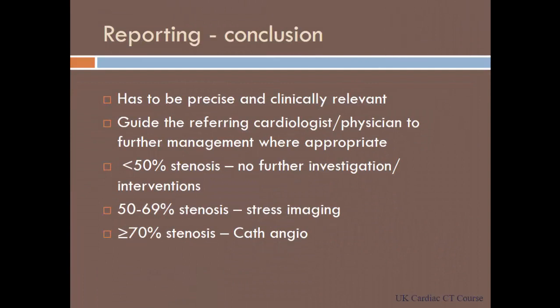The conclusions of the report should be precise and clinically relevant. And you could guide, if you are a radiologist performing them, or if another cardiologist has referred you the patient, then you can guide the referring cardiologist for further management, like how the CAD-RADS document is suggesting. So normally I would say if it's less than 50% stenosis, no further imaging, no further investigation is required. If it's moderate stenosis, I will say do a stress imaging test.